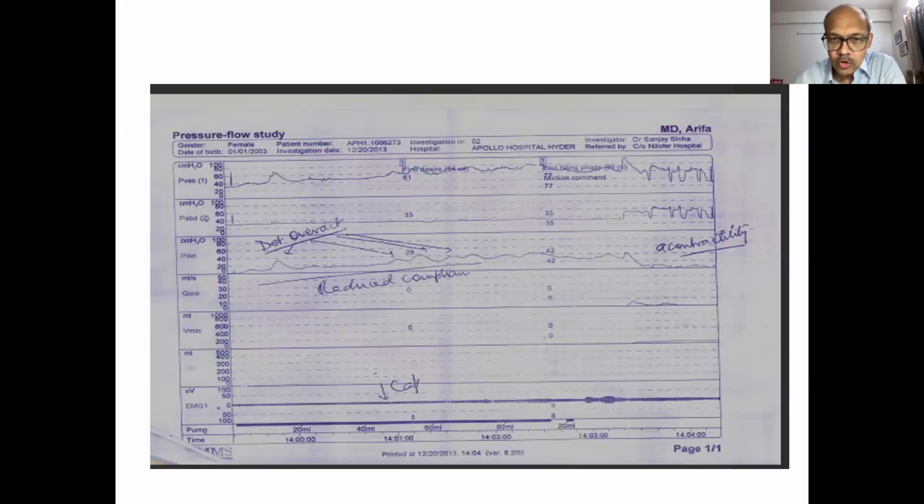And then when the patient is told to pass urine, she strains but doesn't generate a detrusor contraction, and passes with a slow flow. You can see a small amount of urine has come here and she's left a large residue. So she has a small capacity, poorly compliant bladder with detrusor overactivity, acontractility during voiding with abdominal strain, and a large residual. Now, at that time we were not doing video studies, and hence you don't see what's happening. So we really don't know in a patient like this whether the pressures we are seeing are underestimates or not.